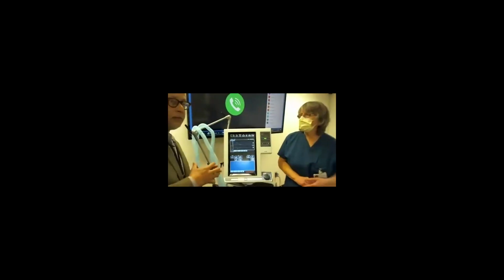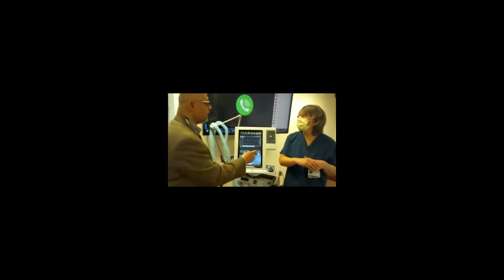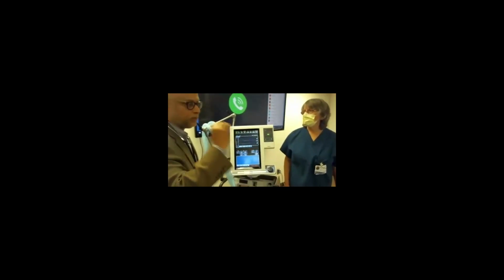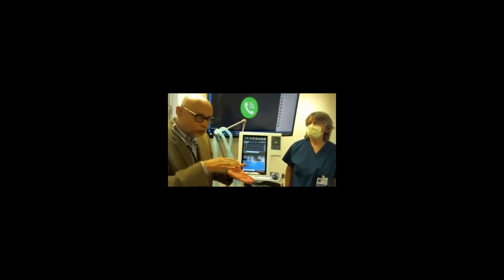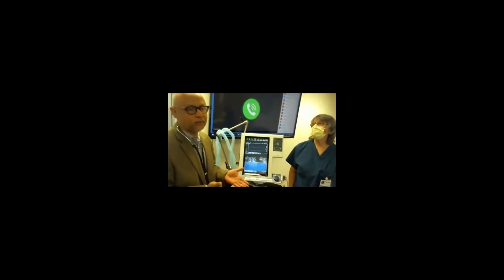So maybe the lung becomes so stiff, like a sponge full of water, that it cannot expand. Then instead of 600, you may get 300, because we are stopping at maybe 35, for example, as the peak we put. So the problem now occurs: we cannot ventilate, which means the carbon dioxide level goes up. O2 may remain the same. Then what happens? pH drops.